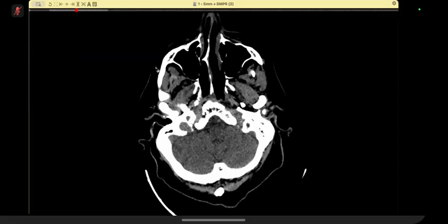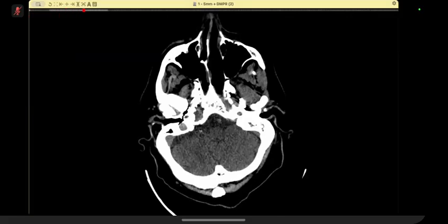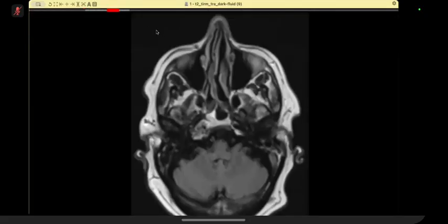Sir, I would like a post-contrast sequence or an MR. Do you have an MRI available? Yes, sir. Please remember, I want to emphasize to everybody, when there is an A and E scenario, an urgent scenario, as in abscess, etc., ask for a CT. Think what happens in clinical practice. This is something which is very chronic. You can ask for an MR also.